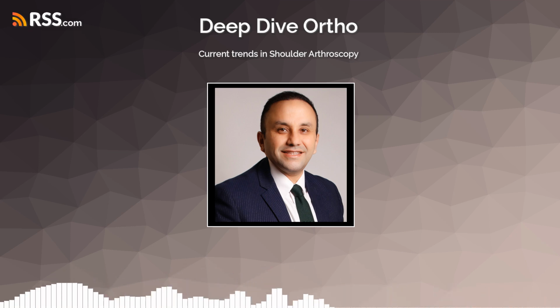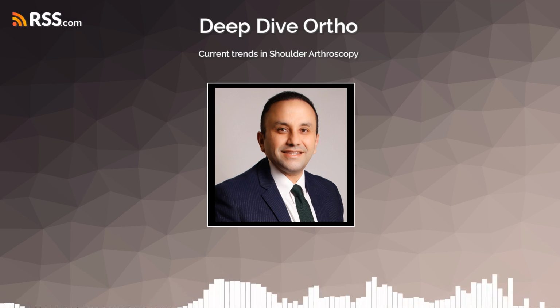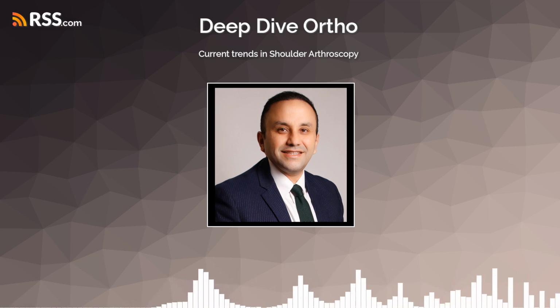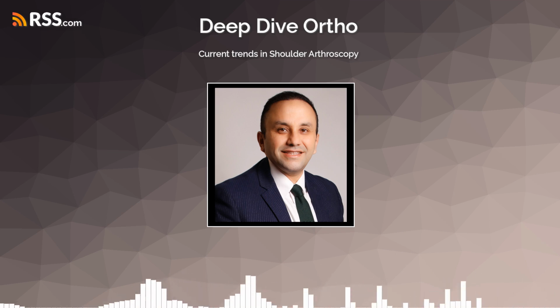What about the humerus itself? Arthroscopic-assisted techniques are also commonly used for fractures of the greater tuberosity and sometimes the lesser tuberosity. Those are the bumps where the rotator cuff tendons attach. Arthroscopy helps with accurately reducing the fracture fragments, clearing out any blood clot, and then fixing them securely in place using screws or strong suture anchors.